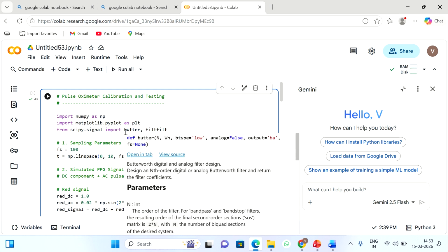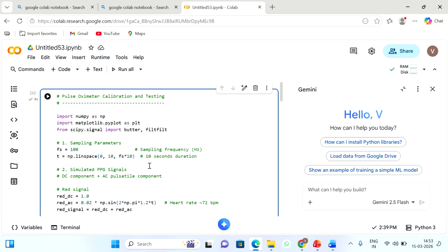So both are enough, so that they are taken from the library, say signal functions. So next one we are taking Fs is equal to 100, the sampling frequency, the number of samples taken per second. Then usually we will take the x-axis time. So linspace, how it is taken, 0 up to 10, starting value 0 and ending value 10.